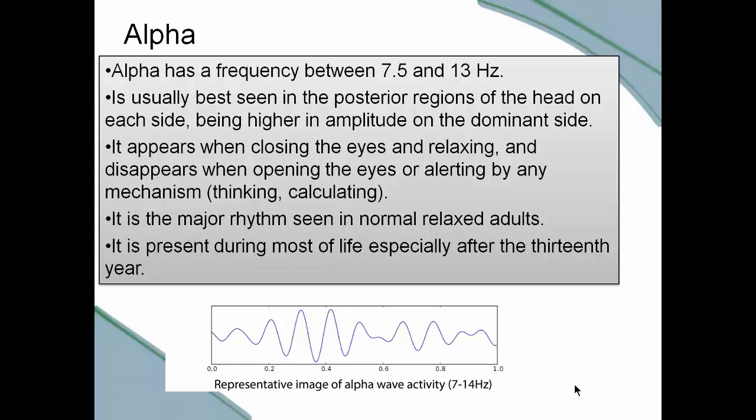But the Muse headband itself, with its own software, by the way, that is a meditation software, and its purpose is designed to do one thing, and that is to help you to get into and stay in longer alpha states, because the alpha state is in fact associated with calmer relaxation, and we could use it in other types of therapy, otherwise called mindfulness therapies.